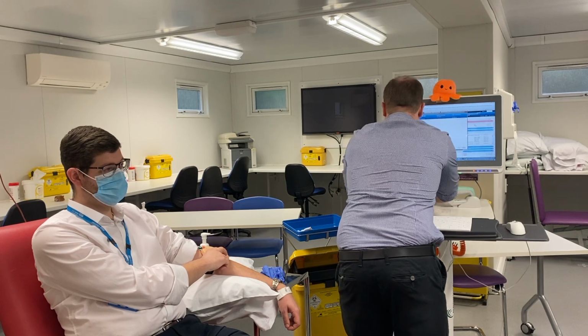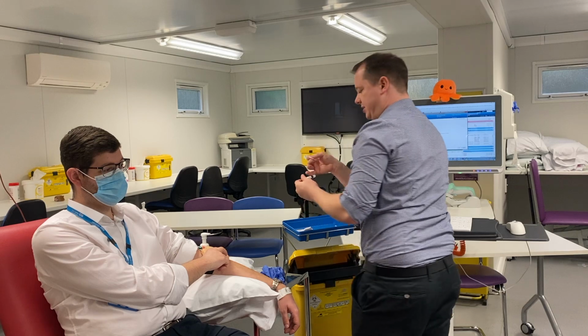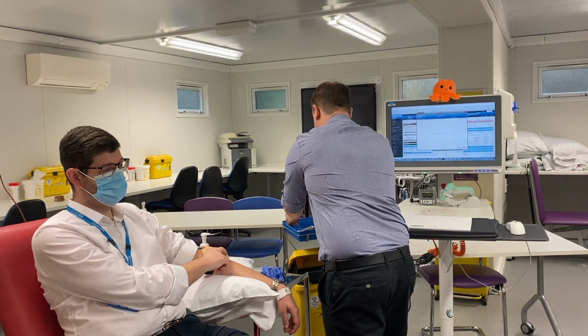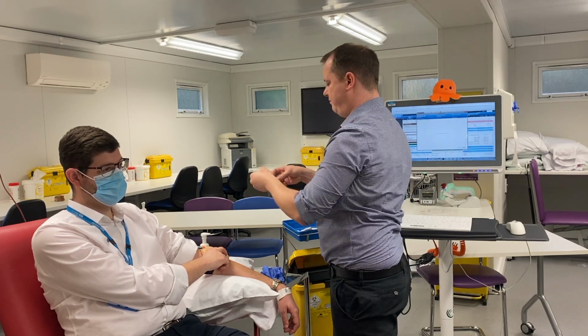I can then label these bottles at the bedside with the correct label. So a brown label for the brown bottle, it's not brown colour, it says it's brown. And then the one that says red on the red bottle.